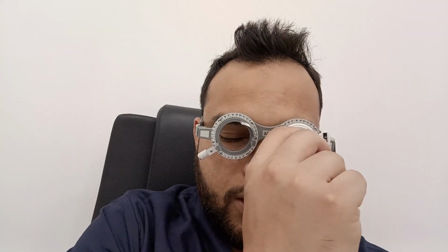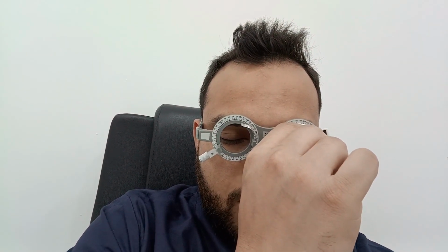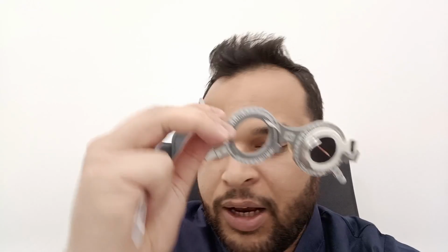The second method we have is the stenopic slit method. We need a piece of paper like this, and we insert it from here. We tell the patient to close their eyes, and whenever it touches the lid, we bend it like this. We measure this on the ruler, and after that we add 2 mm for the lid thickness. This will be our back vertex distance for the eye. So that's how we calculate the back vertex distance for our patient.